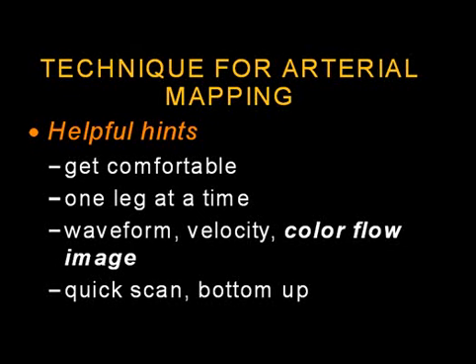Let's quickly talk about some of the techniques for arterial mapping and just go over very quickly some helpful hints. One of the things that I like to say is that the technologist should get comfortable before the start of the examination. These exams can be quite labor intensive, can take up to 60 to 90 minutes to perform, and you really want to be comfortable before you get into the room. Get all the information that you need, all the equipment that is necessary in order to complete the examination.